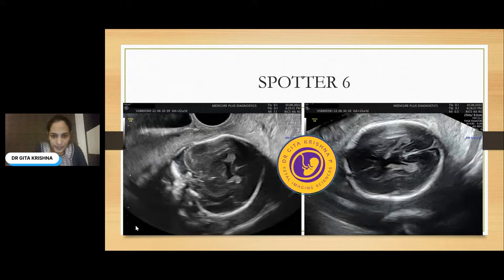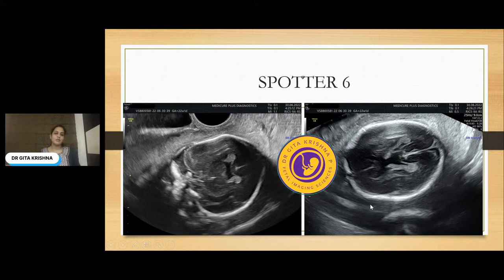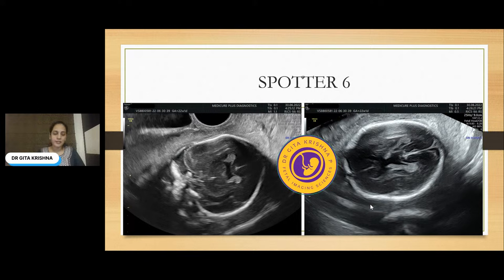The next spotter is a case of a 22-week-old fetus. This is the axial image and this is the coronal image. Because the fetus is in absolute oligohydramnios condition, I'm unable to provide many images, and this was done in transvaginal view only. What is your diagnosis here?